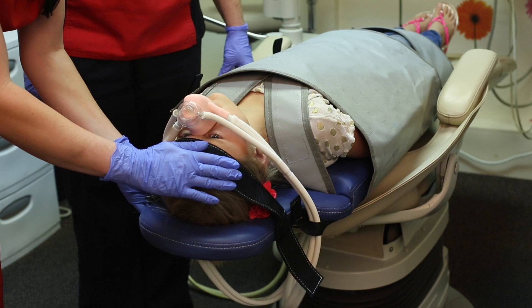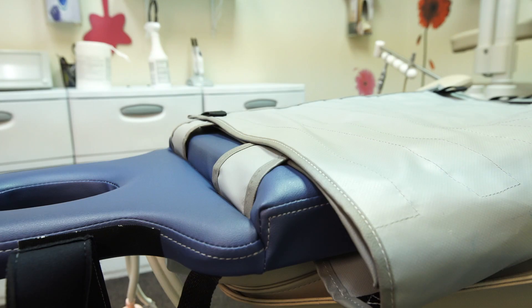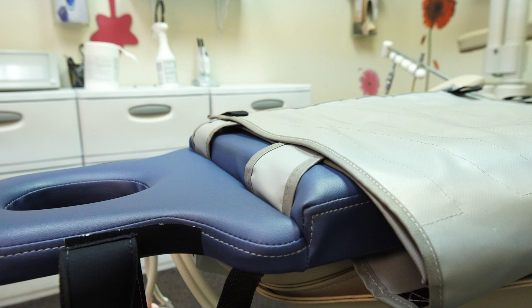If a head strap is needed, secure it to the velcro on the side of the head cushion with the neoprene side down to ensure patient comfort.